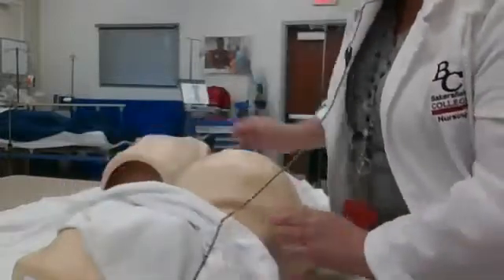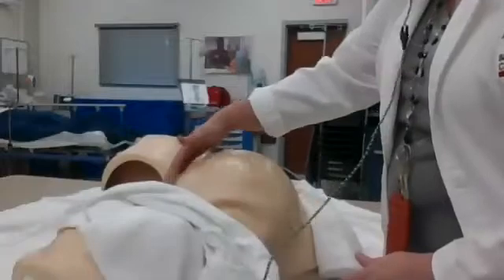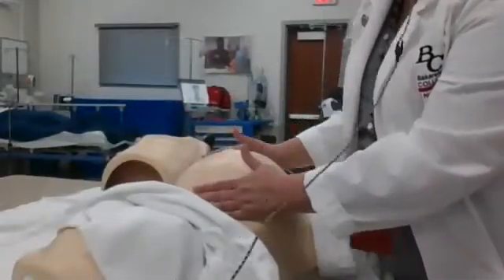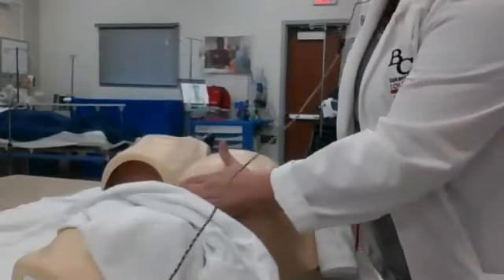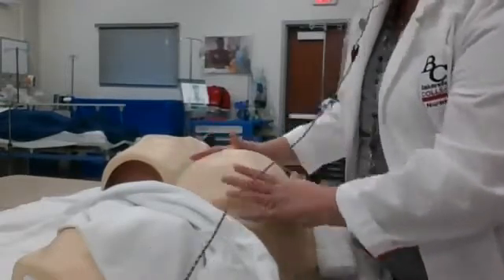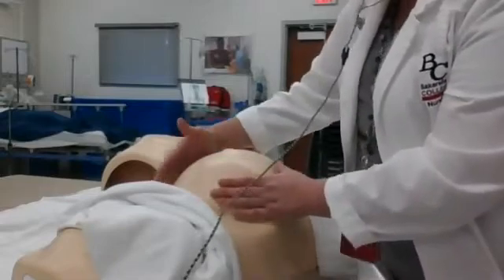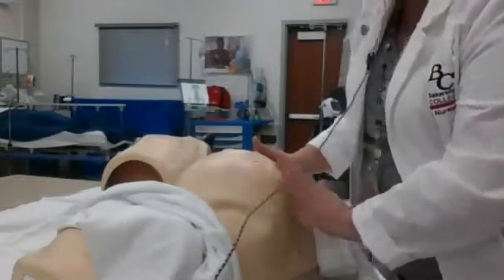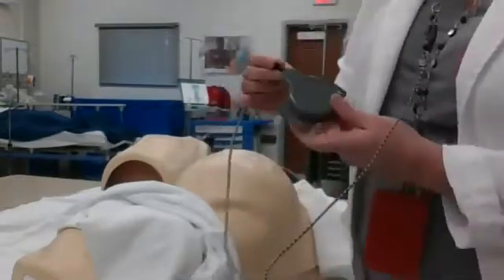Inside here you'll see I have my mom model with her tummy, and I'm going to do a maneuver called Leopold's maneuver to help determine which position the baby is facing. I want to make sure that the baby's head down — we'll talk about exactly what we're feeling for in class. So you're going to feel where the baby is and try to find the back of the baby, because that's how these monitors work the best.